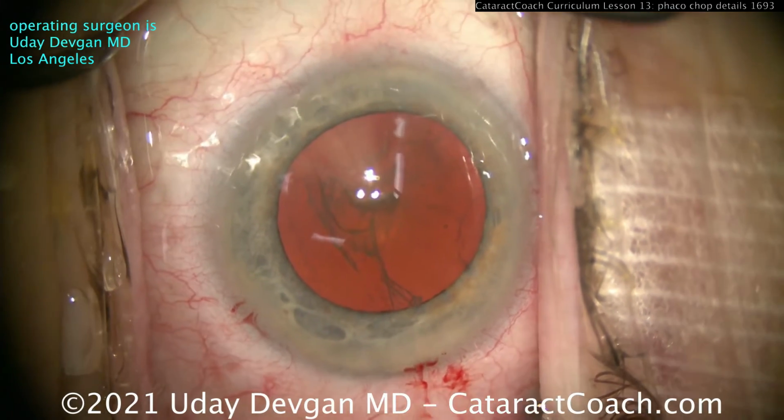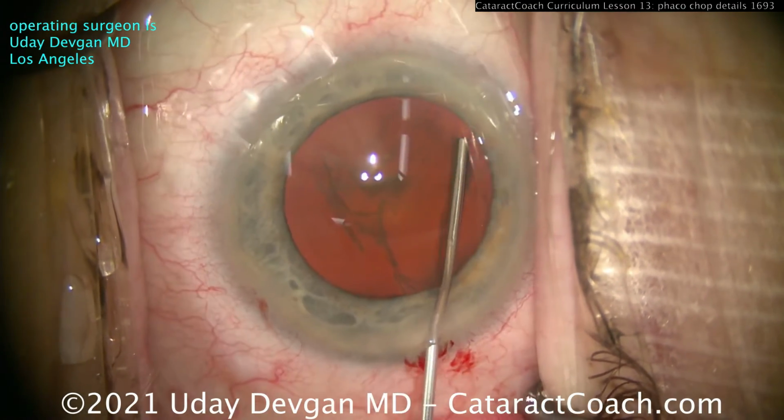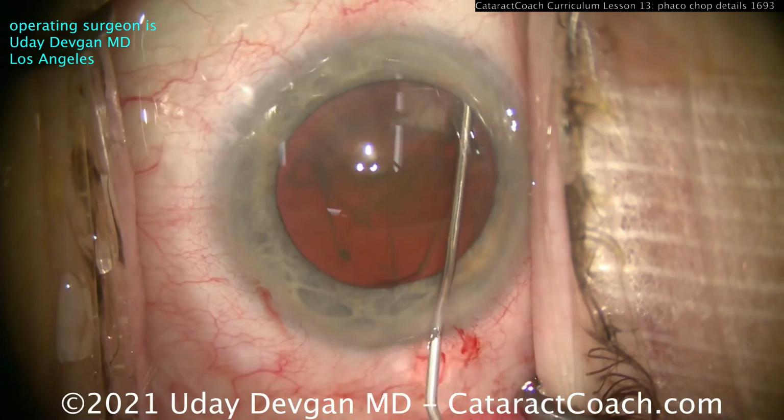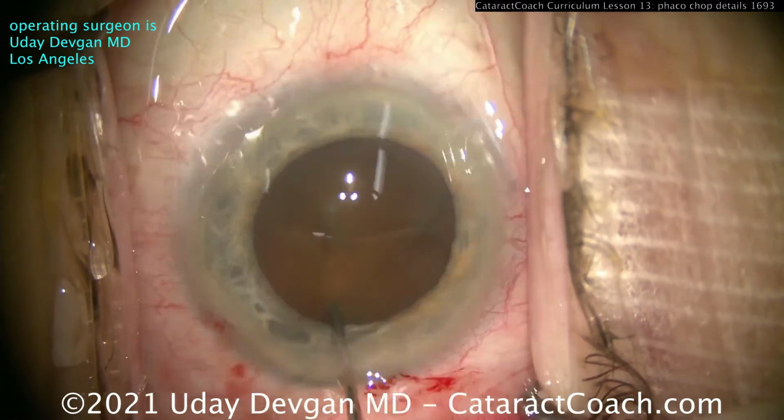So there's that rhexis, looks fantastic. Let's get some hydrodissection. Now you'll notice more of the nuclear density here with that hydrodissection. Fluid waves going around. And let's again make sure the nucleus spins.